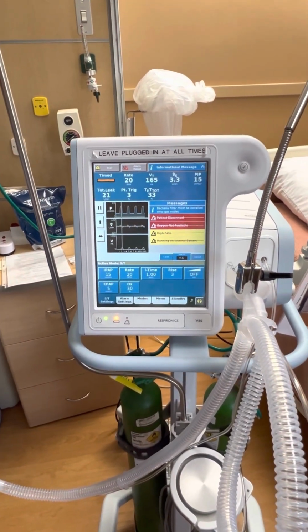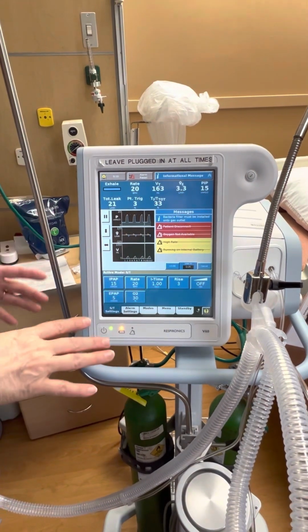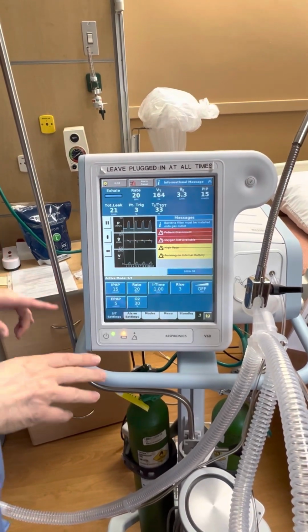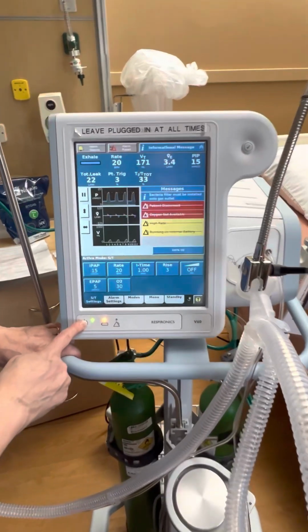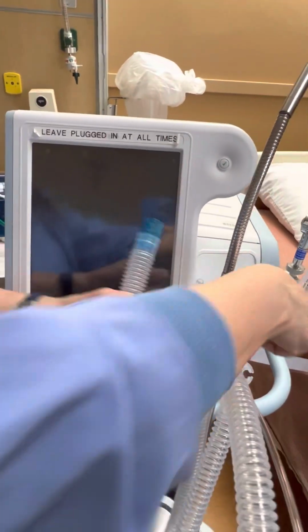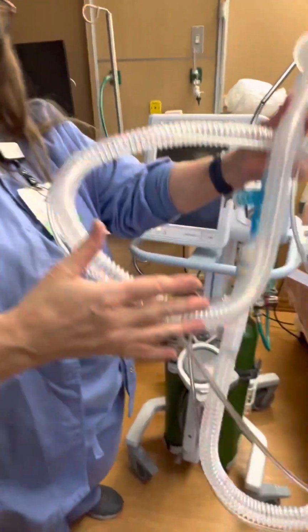So when it's time to turn this off and time to clean it, it is the nurse's responsibility to clean the equipment and reset it back up, because I'm not here every day, nor will I always be here, so it's their responsibility. Do not push it back into storage until this has been done. So you take and you turn it off, ventilator shut off. Now, what all gets thrown away? You take all this off, and that is all disposable.